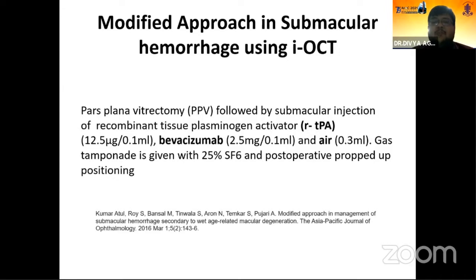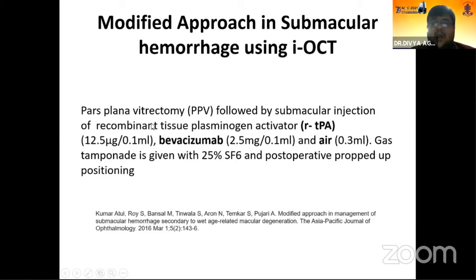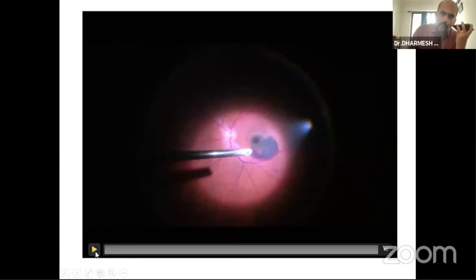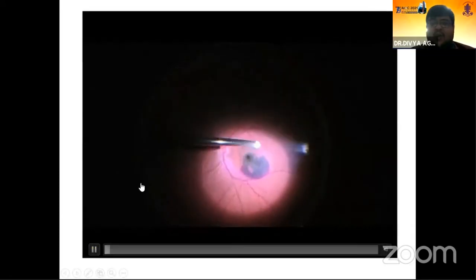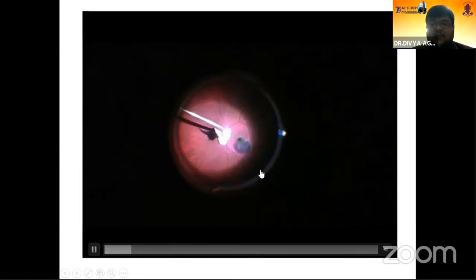We performed pars plana vitrectomy for submacular hemorrhages, in which we did pars plana vitrectomy followed by subretinal injection of a cocktail of recombinant tissue plasminogen activator. Here, as we can see, the hemorrhage is involving up to the vascular arcades and the center of the fovea.